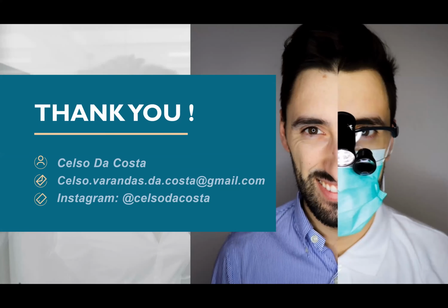Yeah. So if you have to deal with difficult cases, you prefer to use a combination with maybe Click and home. Okay. How do you deal with non-vital teeth? Yeah, most of the time we are doing the internal bleaching in the non-vital teeth, and then we can do the whitening for the other teeth. Normally I start with the Click. If I get a good result with the Click and we don't see any difference, spot on, really good. If we still have some difference, I do home whitening, because we can control it a little bit better. Every day we can see the difference till the day that we don't see any difference at all. So that's what we are doing for the non-vital internal bleaching, and then we start Click and home bleaching if we need it to get the same color in every tooth.